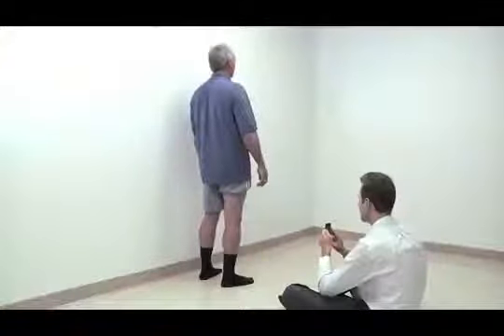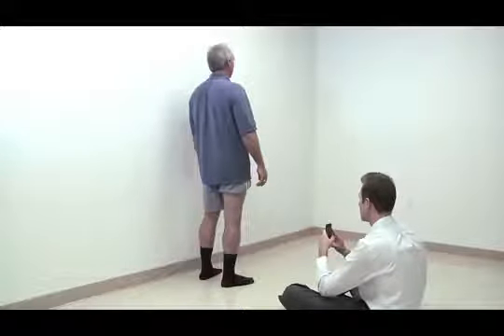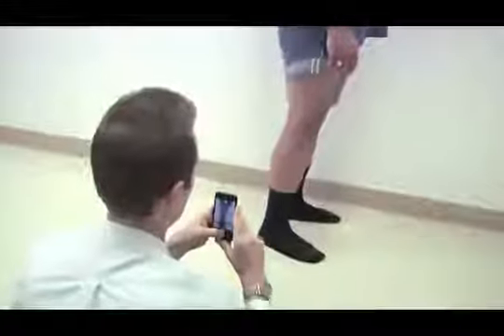Next, take your lateral picture. Have your patient turn 90 degrees with their knees slightly bent and line the middle horizontal line with your knee axis line. Once the indicator has turned green, take your picture. Now that you've completed your anterior and lateral photos, complete the other sections in the app and place your order.